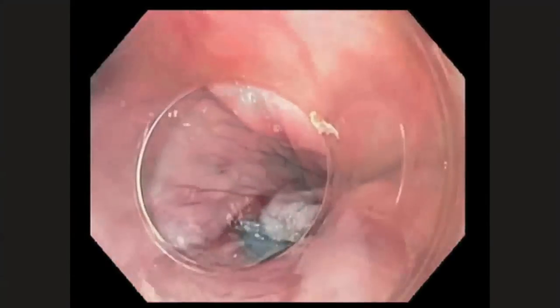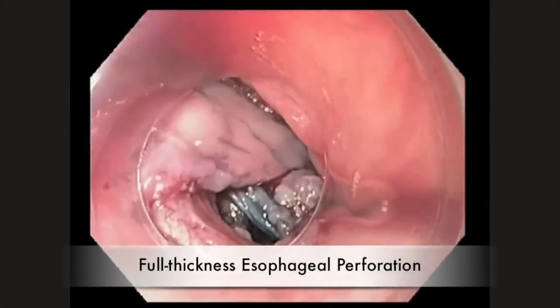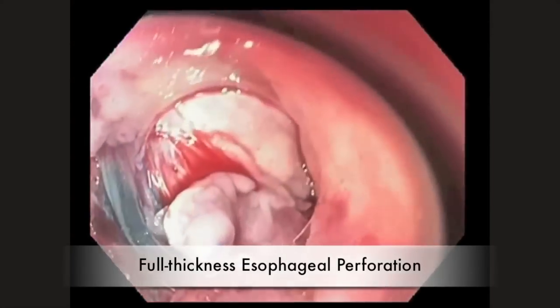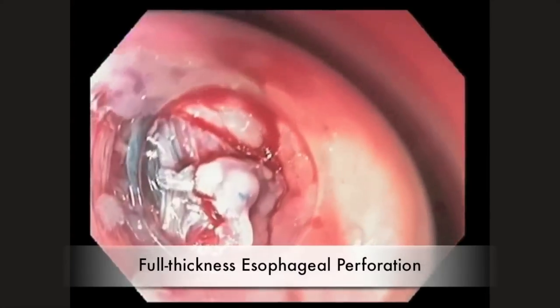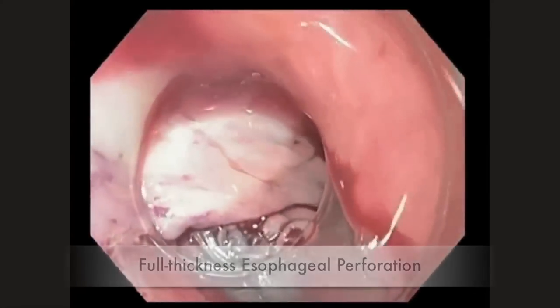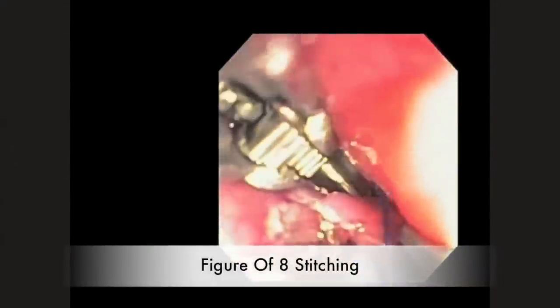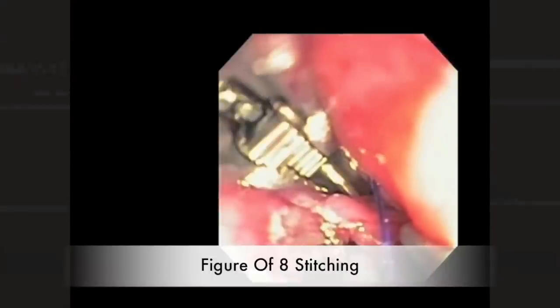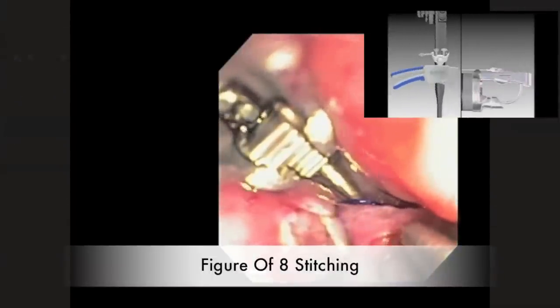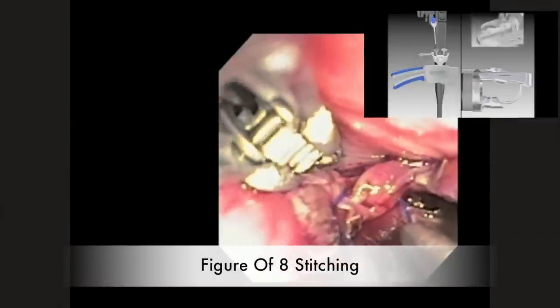Here we present a case of full-thickness esophageal perforation in the mid-esophagus. One can see that the perforation measures about two centimeters in size. Given the size of the perforation and the quality of the tissues, the endoscopic suturing device was used to close the perforation. One can see the mechanism of the overstitch in the top right corner.